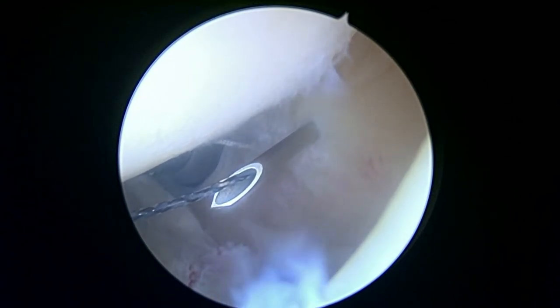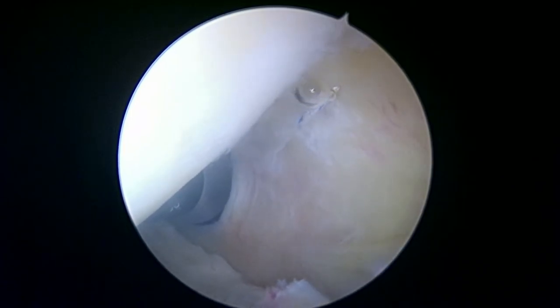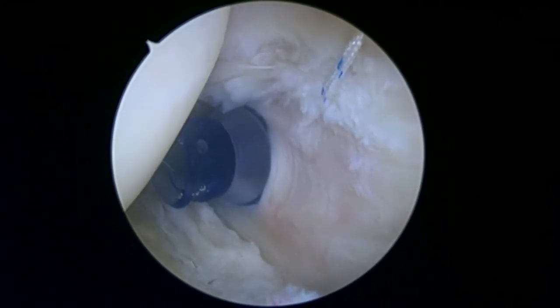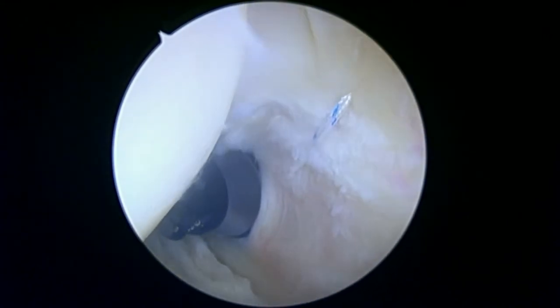Now let me get the grasper again. And so you can see with that permanent suture, this is a very strong suture, but you can see how that's going across that split, and that'll keep that split from getting worse. And if we have to actually add an anchor to this, we certainly will. But this will allow us to find this area very quickly on the other side.